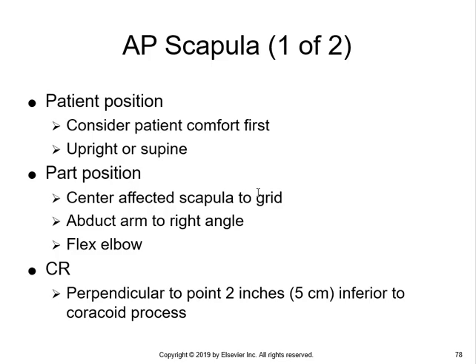So if you have an adult patient with shoulder injury or even a humerus injury, you need to start thinking grid use. If you've got a kid, a young patient, in a lot of cases you don't necessarily need a grid, but for an adult you probably do. So humerus size, shoulder size certainly, and everything that we've talked about past the shoulder, AP and the internal external rotation of the shoulder. So grid use.